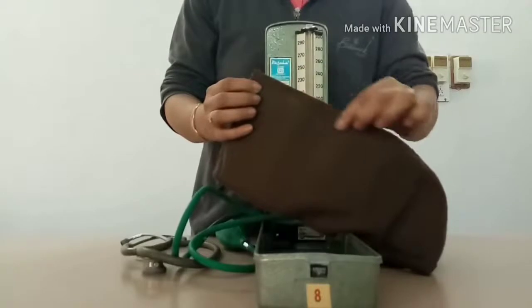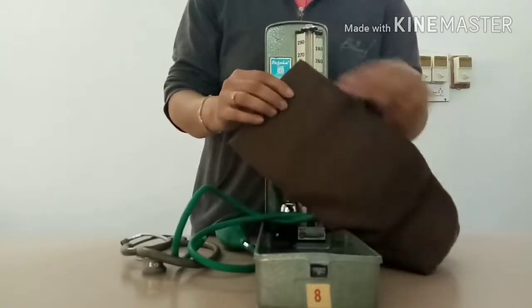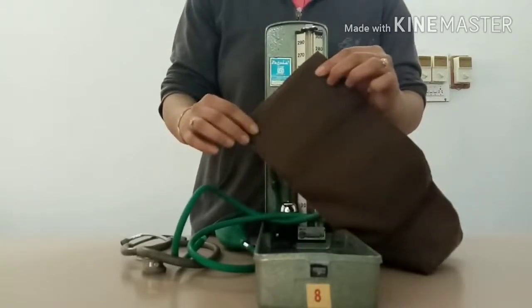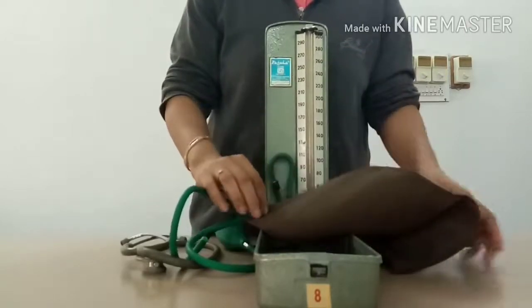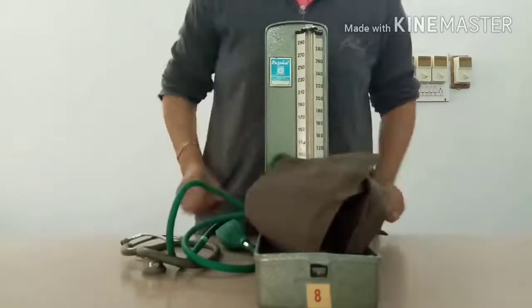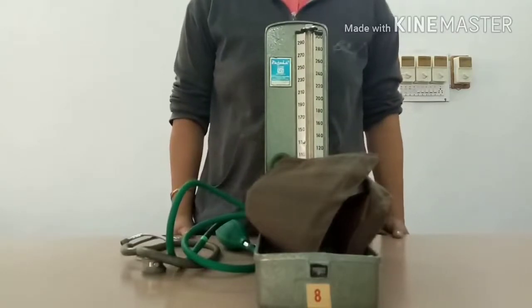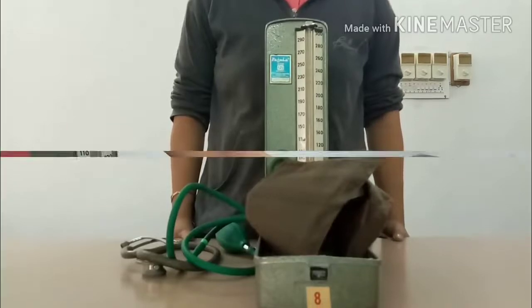Inflatable bag dimensions: length to width ratio is 2 to 1. Therefore, wider cuffs should be used to record blood pressure in obese individuals and in lower limbs, and small cuffs should be used to record blood pressure in children.